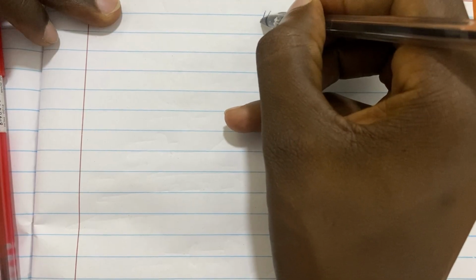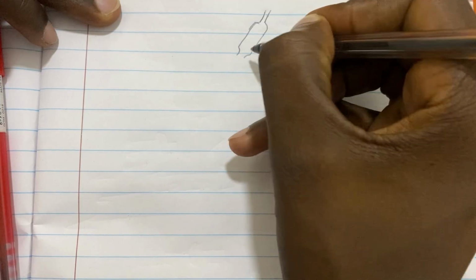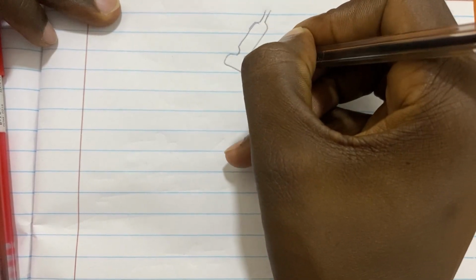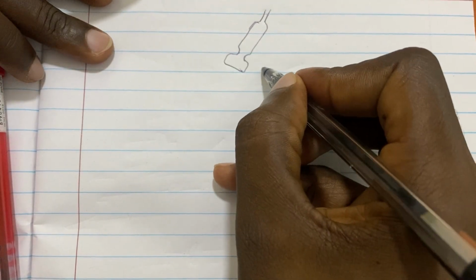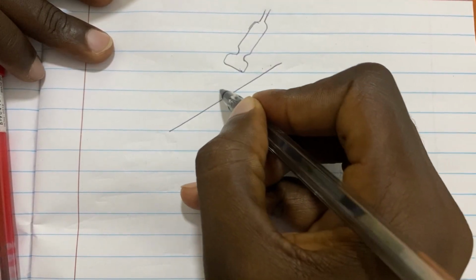Let me use a clear image here. We have a probe here, and then we have this blood vessel.